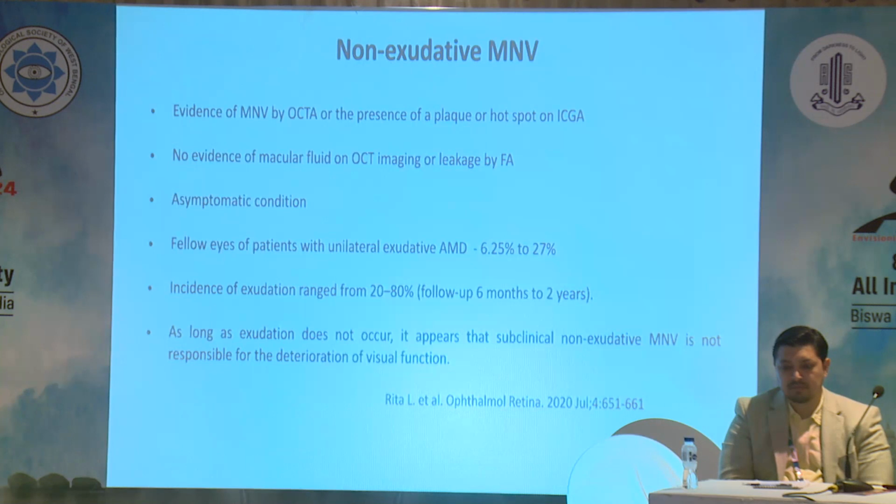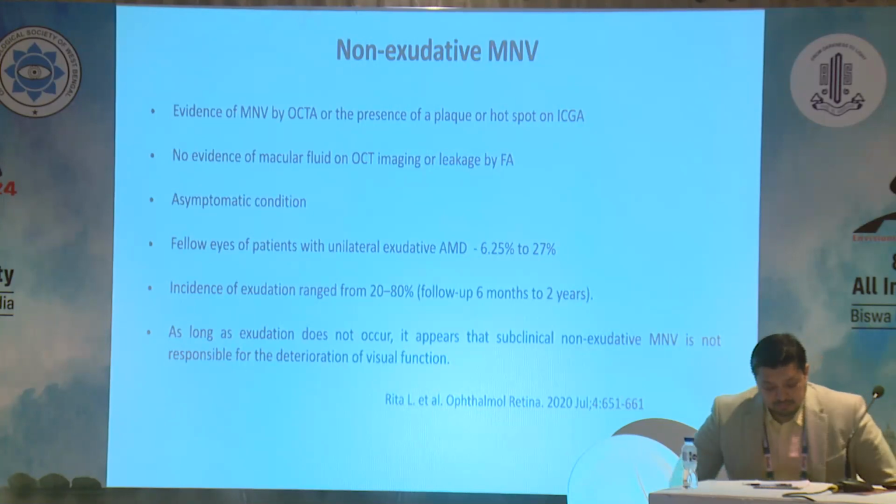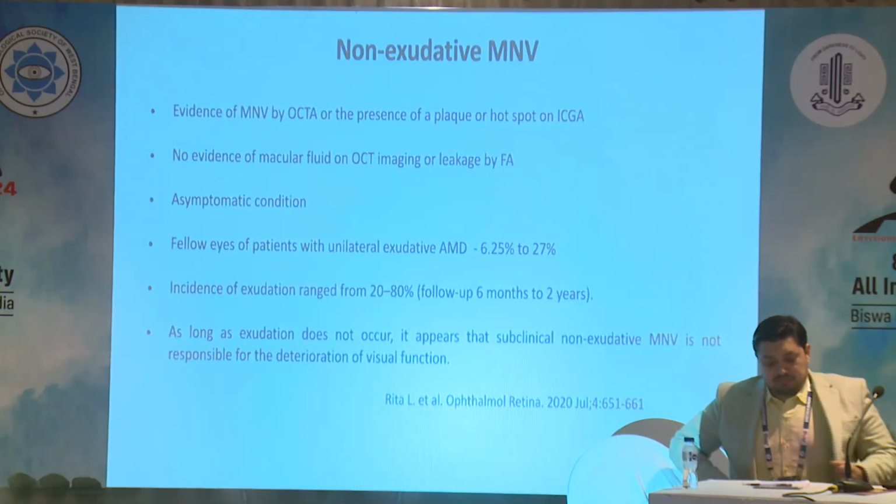I think in the first presentation only, Vinod asked a question, and the major role of OCTA was highlighted, that is to see occult CNVMs or MNVs and the FAZ. I think this is the mainstay for today, even for a basic OCTA, which is there, and it can't replace the other invasive procedures for that.